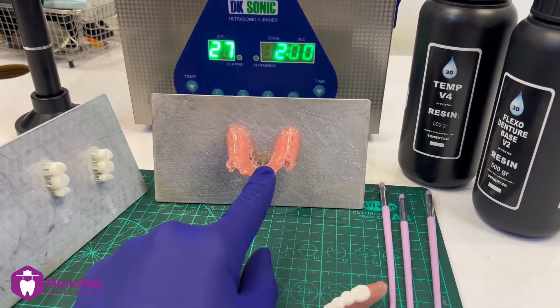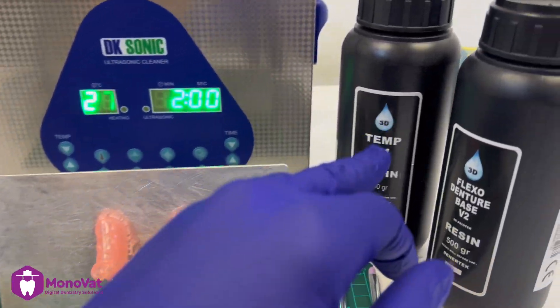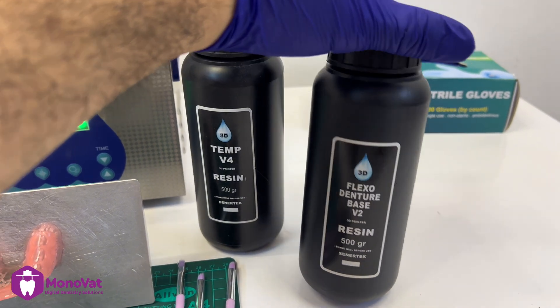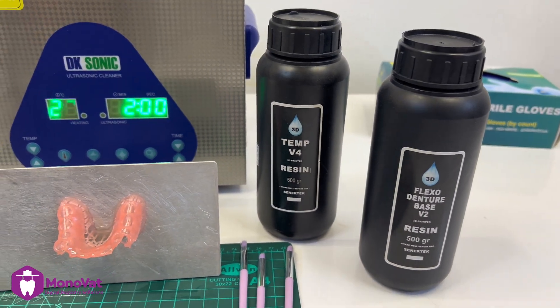First, I printed the denture on this platform and the teeth on the other one. I used the Flexo denture base from Senertek for the denture, and the Temp V4, also from Senertek, for the teeth.